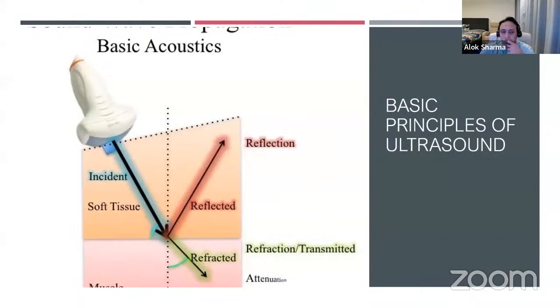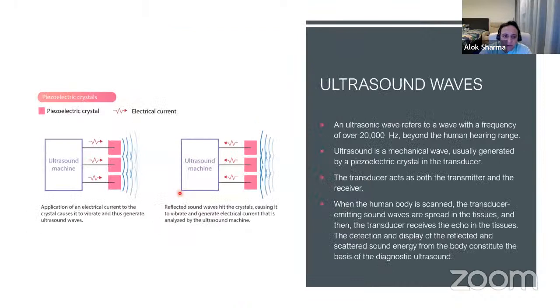Now, a very simple approach in lung ultrasound is first having a little bit of an idea about what lung ultrasound actually is, but before that, how ultrasound is actually used. Whenever we use an ultrasound probe, we are looking to deliver ultrasound waves. These waves will interact with the surface of the area that you're scanning, then the tissue beneath it, and then deeper tissue. What we are then looking at is an image generated by the waves that are reflected back. So reflection is the foremost mechanism of giving us images when we perform ultrasound.